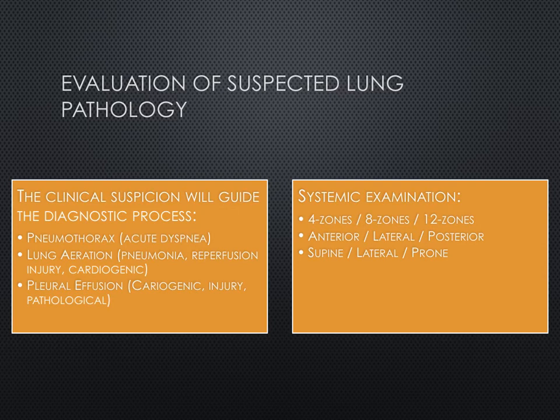And then you would want to continue to evaluate at your lung bases just to see if you did have that diaphragmatic movement and if you had that curtain sign, because that could give you some very valuable information about any potential significance of the pneumothorax that might have occurred within that lung.